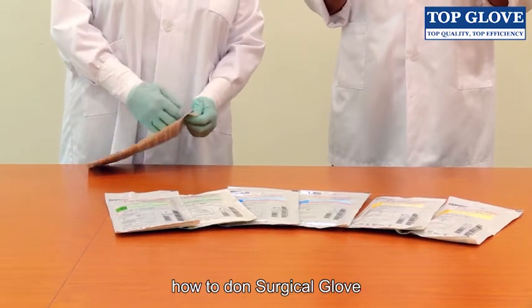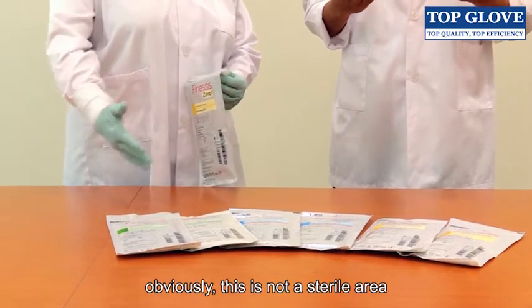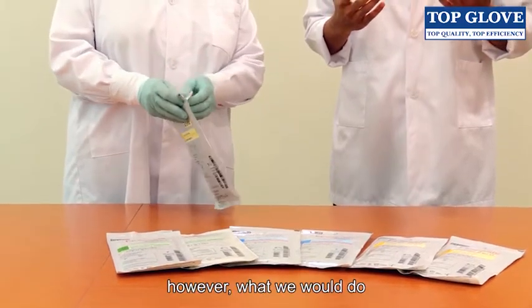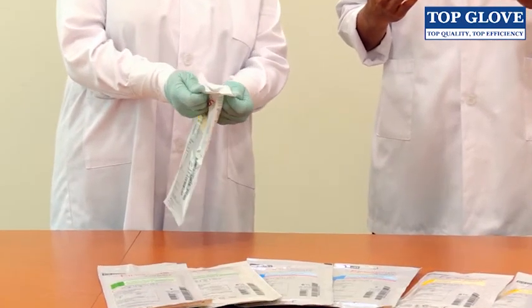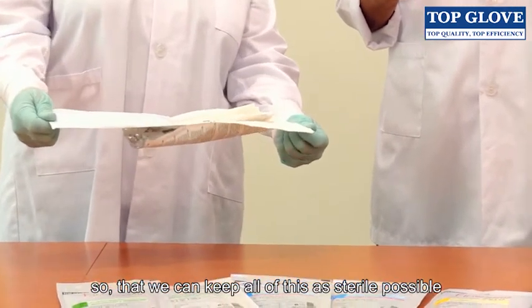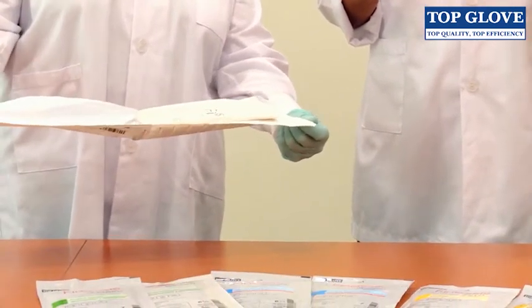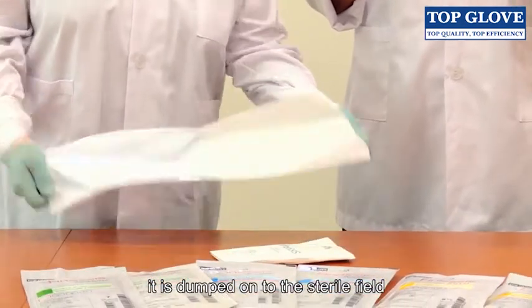Hello, today we're demonstrating how to don a surgical glove. Obviously this is not a sterile area. However, what we would do is initially open the envelope, making sure that we're not touching anything on the inside, so that we can keep all of this as sterile as possible. Then, when the wallet is exposed, it is dumped onto the sterile field and the envelope is kept away.